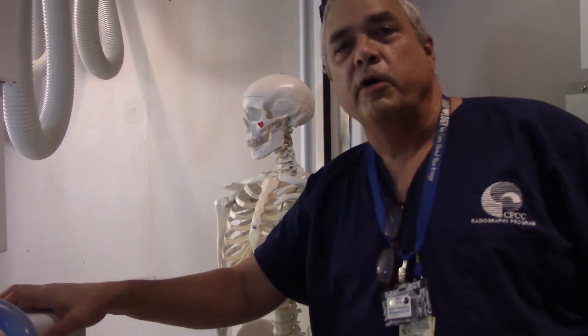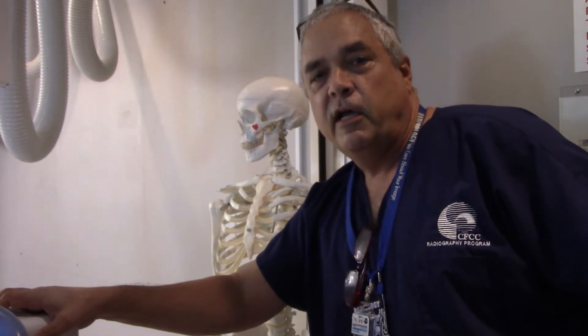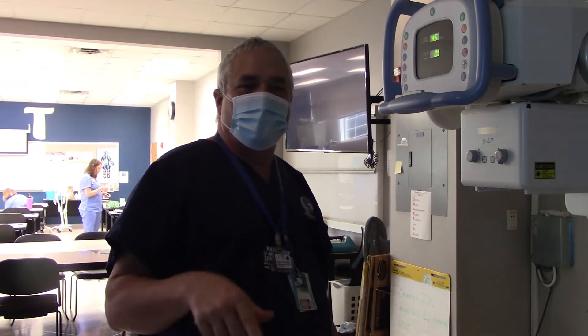Thank you for joining us for this quick lesson on upright abdomen. Now we've already done our upright abdomen and we're going to do our supine.